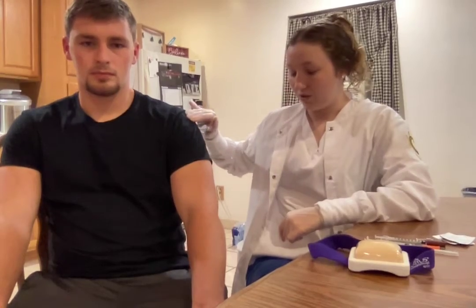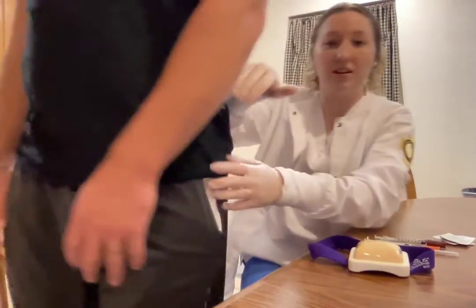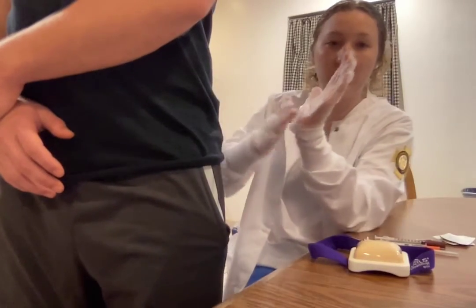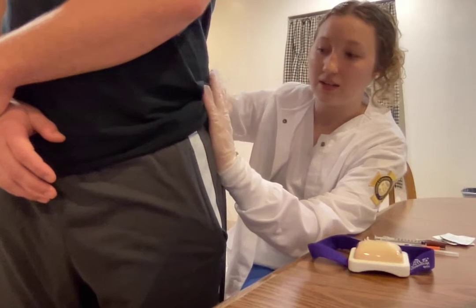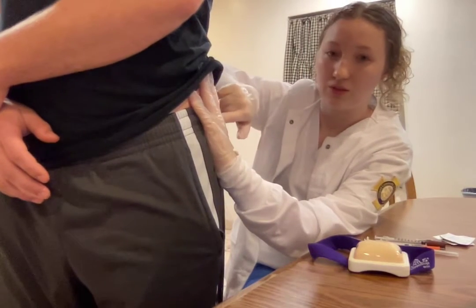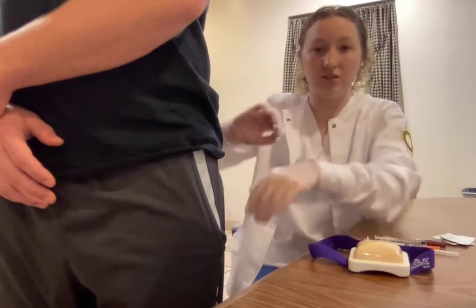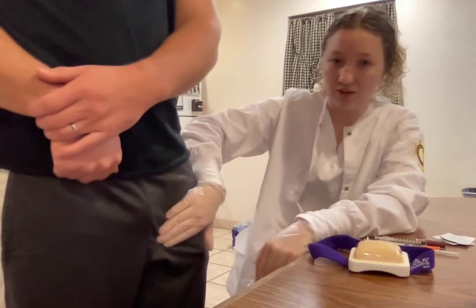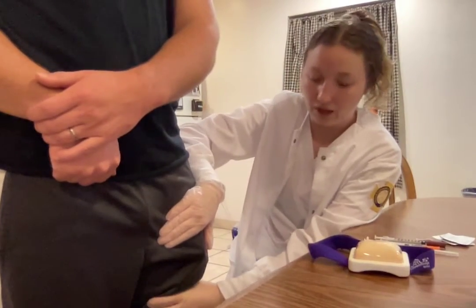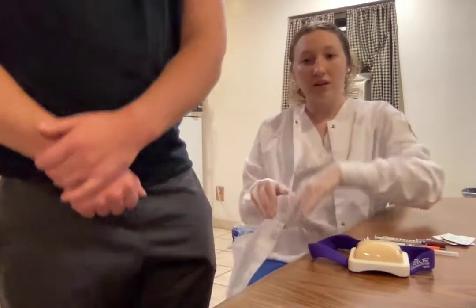And then to do ventrogluteal, I'll have you stand up like that. And then I'm going to put the heel of my hand on their greater trochanter, and then it's just in between those 2 fingers right there, and give that in the muscle. And then to do vastus lateralis, you're just going to put one hand on the top of their thigh and then one hand right above their knee, and you can give it anywhere in that area of the thigh.